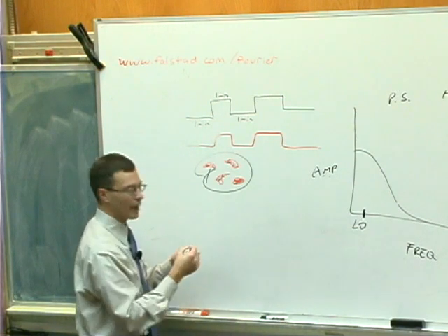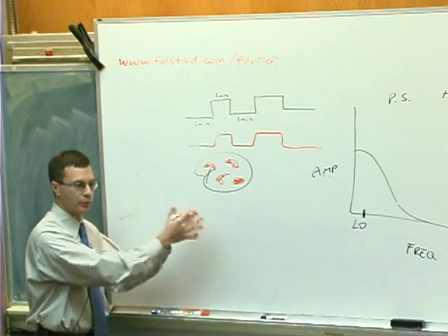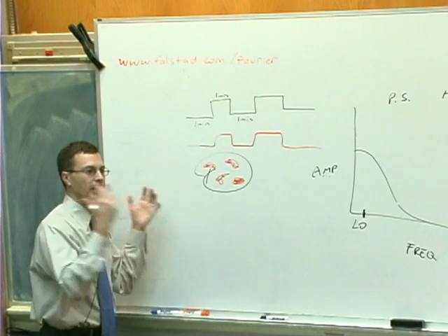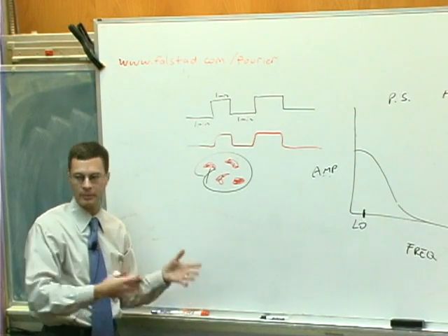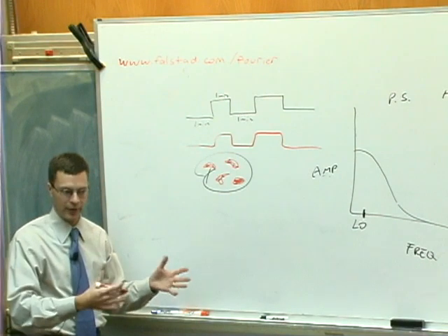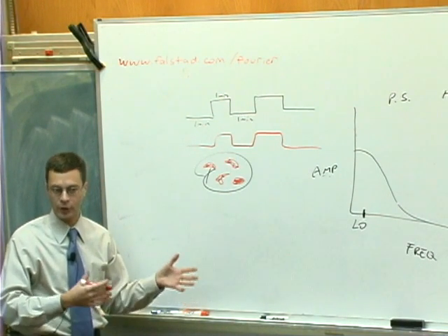Okay, so there's red dots all over the brain. And they say, look, eureka, I found that most of the brain responds with a greater response to semantic judgments about Braille reading as opposed to semantic judgments about pictures. Okay, so now you, as the world-weary faculty member, what's your objection to what's been done so far? Someone's got to raise their hand, or I'm going to start calling on you.